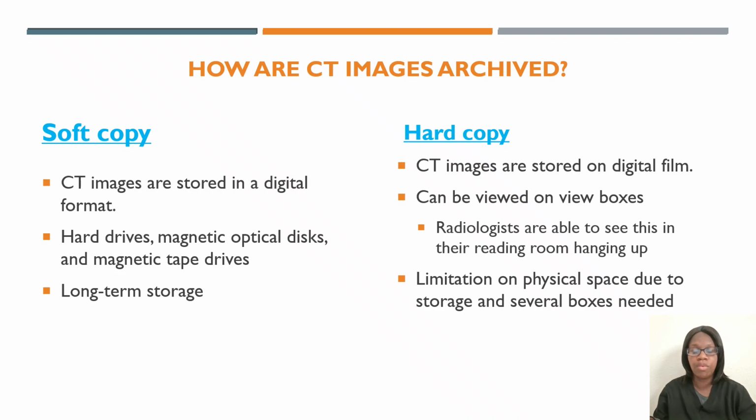So if you have ever walked into the radiologist's reading room, you'll see a view box where their images can be hung. You may not see it as much now because there aren't a lot of films being brought in, but occasionally, when I work in the mammography department, I still see patients from other states or maybe another country who have had film saved.